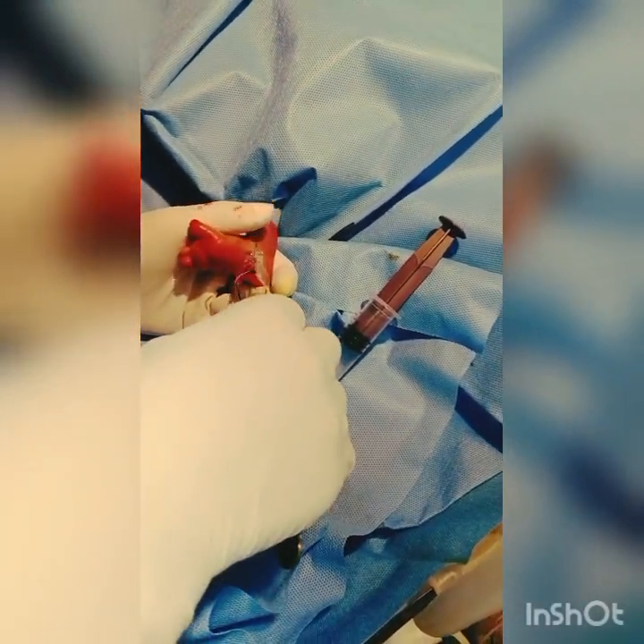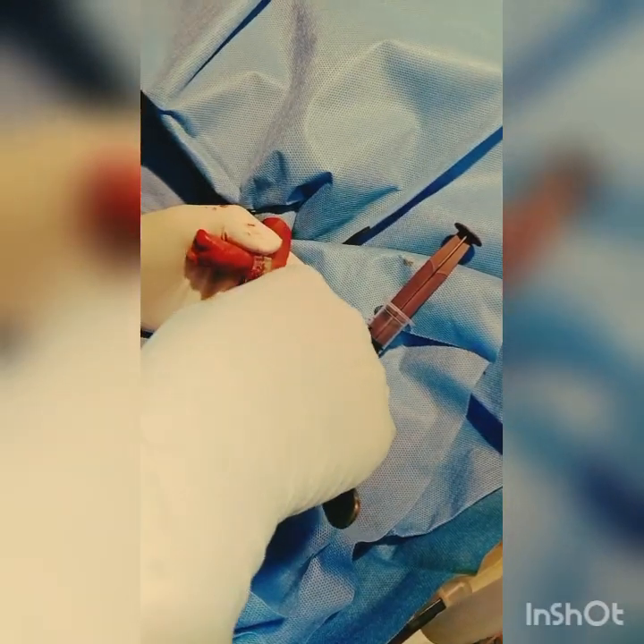Cotton. Close, close to the entry. Hold it close to the entry point.